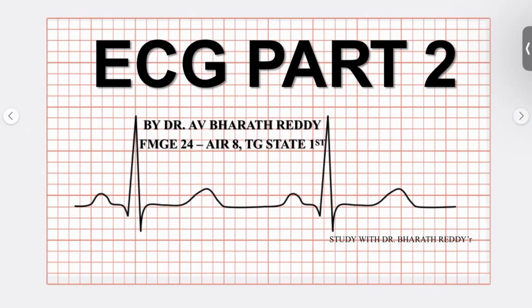Today we are going to discuss ECG part 2. Last week we discussed bradyarrhythmias, tachyarrhythmias, and the basics of ECG. Today we are going to discuss ECG part 2, especially ST elevation, U waves, J points, and Osborn waves, and some specific findings of pericarditis, digoxin toxicity, and electrolyte imbalance.